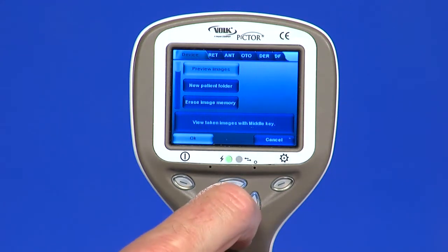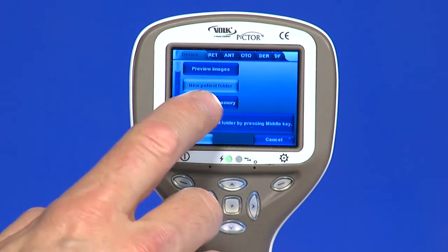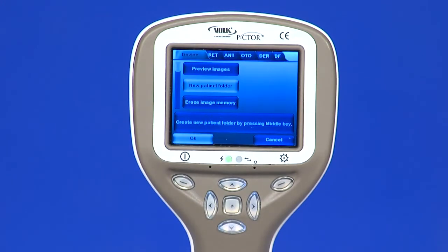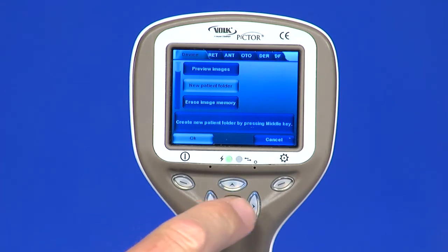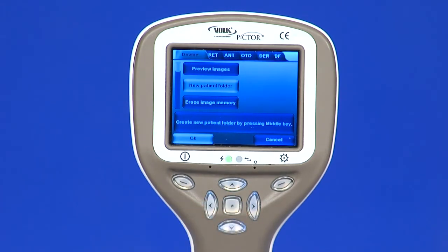It is recommended to always study full resolution pictures on a computer screen. New patient folder: a new patient folder is created by pressing the middle key when the new patient folder selection is active in the device menu. A new patient folder could also be created by pressing the middle key for 3 seconds when in live view. If the current patient folder is empty, a new folder cannot be created and patient 1 folder is used.